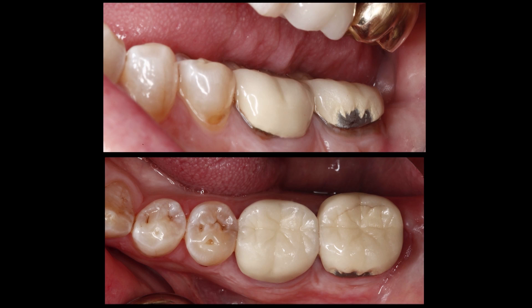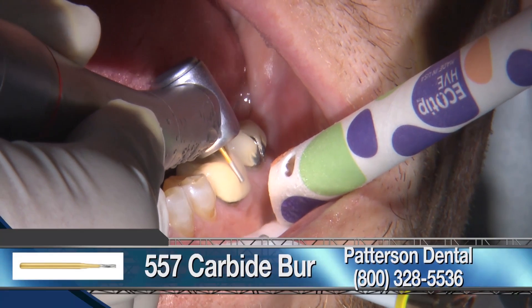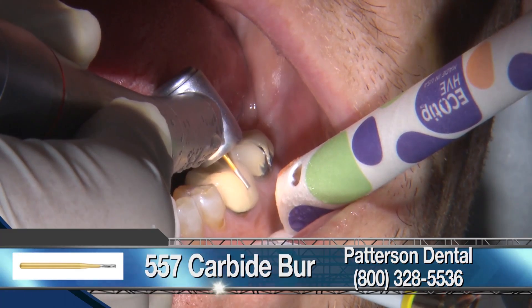For this case, we have existing porcelain fused to metal restorations on tooth number 18 and 19. As you can see, the buccal area of 18, the feldspathic porcelain has chipped away near the margin. So first things first, we are going to remove the existing crowns.